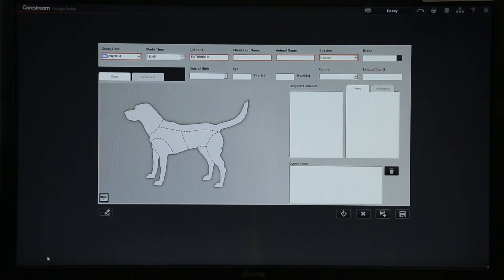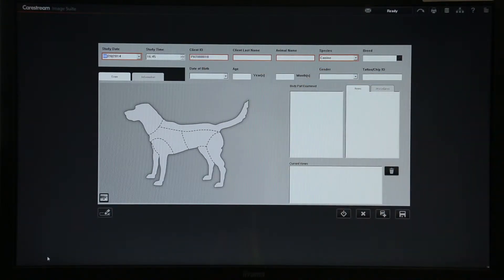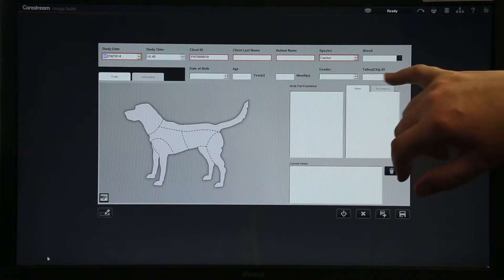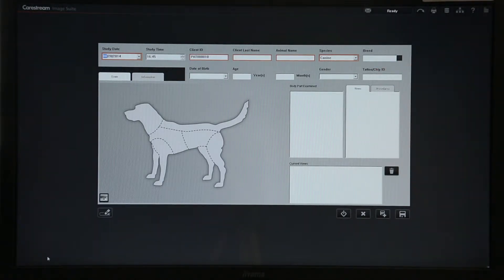First of all is study date, which the machine will fill in for you. The next option is client ID number — if your practice management system produces a number you can input it here. Alternatively if you're doing a hip score, we recommend using the Kennel Club number in that box, as that will be part of the image. You can then use the tattoo/chip ID number field to give the patient their tattoo or chip ID number, and again that will be part of the image and keeps the BVA happy.